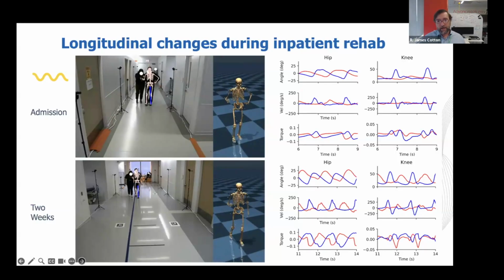So is this right? Absolutely not. We are not scaling masses. There's a lot of things, or moments of inertia. There's a lot of details if we really wanted to get it accurate at the level of what we'd get with a ground reaction force. But I'm more interested in: can we pick up clinically meaningful changes? And this is looking quite promising.